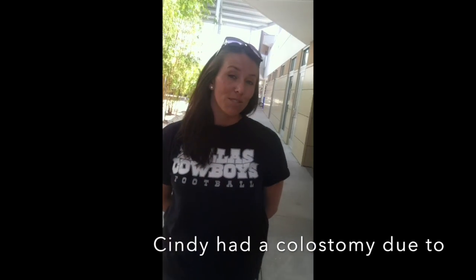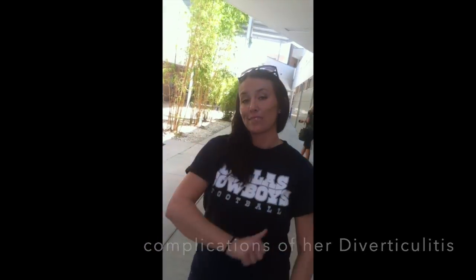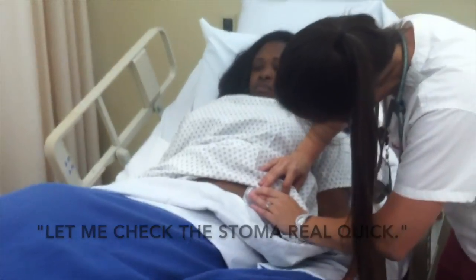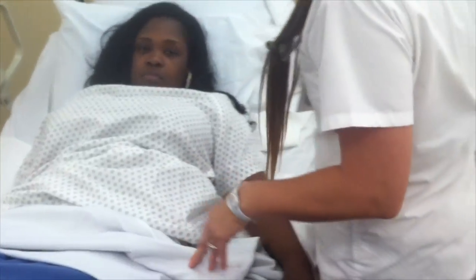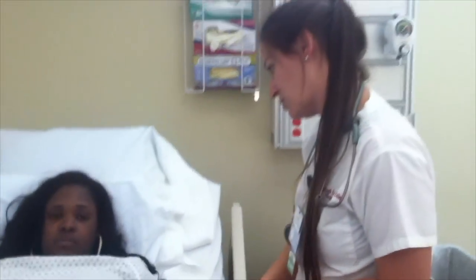Today we're going to be doing a little documentary on my friend Cindy who's just received a colostomy bag. Let's go on in her room and check things out. Everything sounds really good right now. Let me check this thing real quick — make sure it's the right color. No swelling. Very good. Alright Cindy, since you're being discharged I'd like to go over a couple of things with you, mainly how to take care of and clean your stoma.